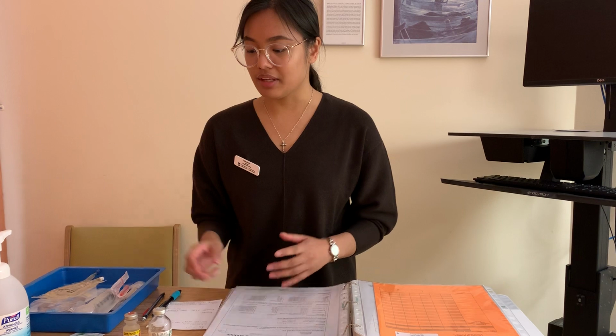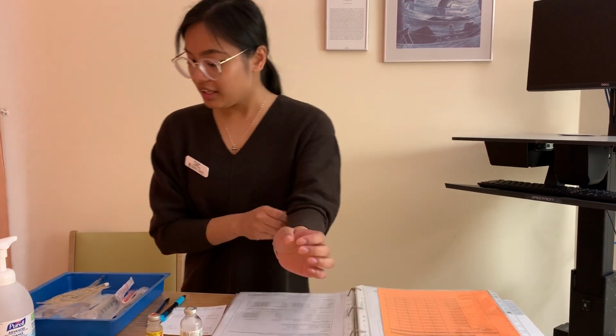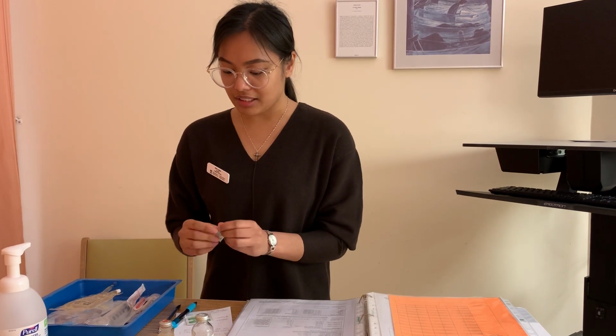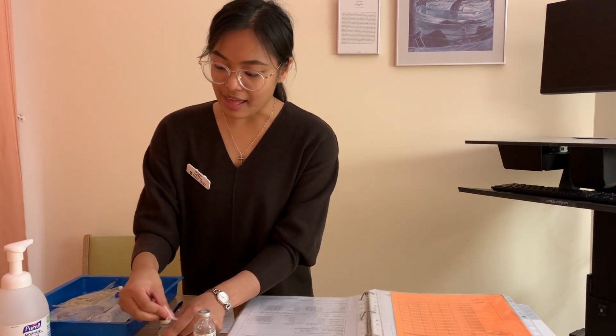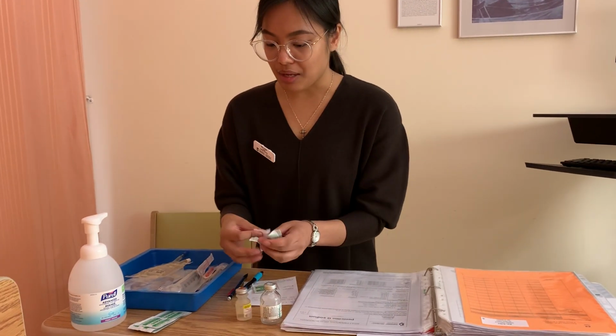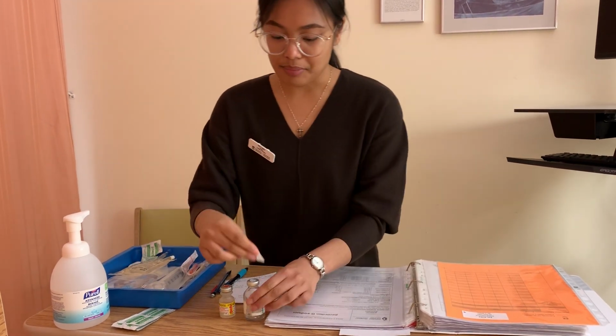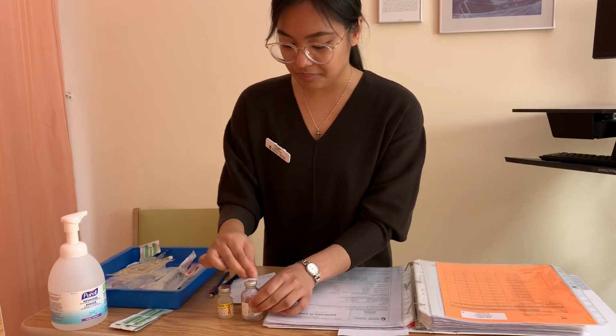Now I'm just going to get my medication supplies ready. So for the purpose of the video, I'm just going to swab for 30 seconds and let dry for 15. I'm just going to quickly demonstrate that. But every time I say that, I will just demonstrate that quickly for the video. So I'm swabbing the tops for 30 seconds, let dry for 15.